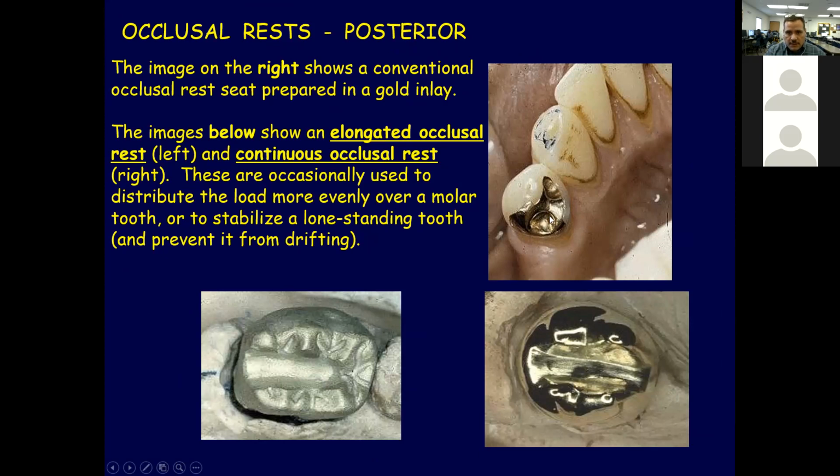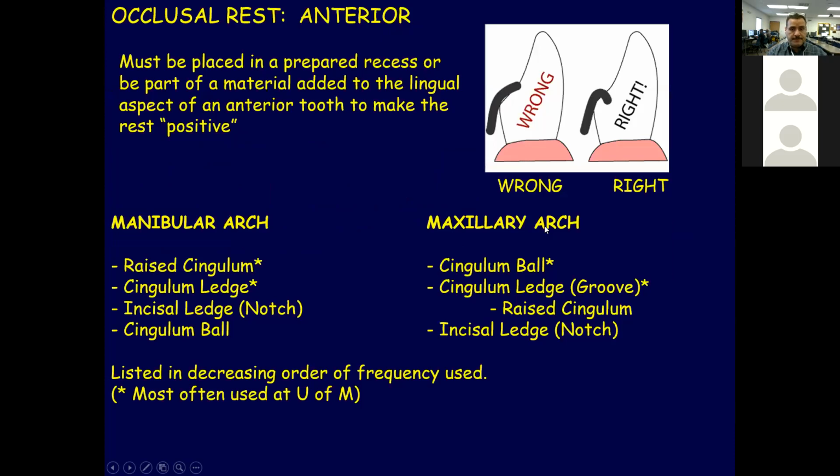Okay, so this is an occlusal rest. Sometimes in the anterior, they call it cingulum rest. This is a premolar, and the dentist makes a 3/4 crown, and in the crown he makes a concavity for the rest to sit. And this is a crown. This is another crown. Sometimes they use gold inlay and onlay. Well, we can talk about the gold inlay. It's a type of filling made of gold. And all this is to prevent damage to the teeth and prevent decay when you use a partial denture.